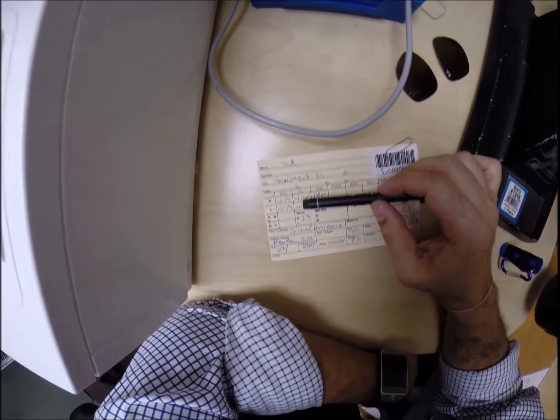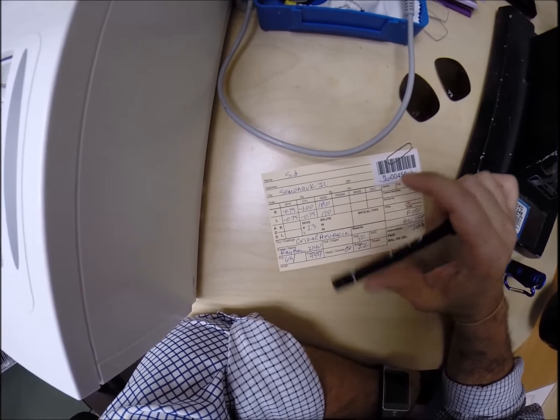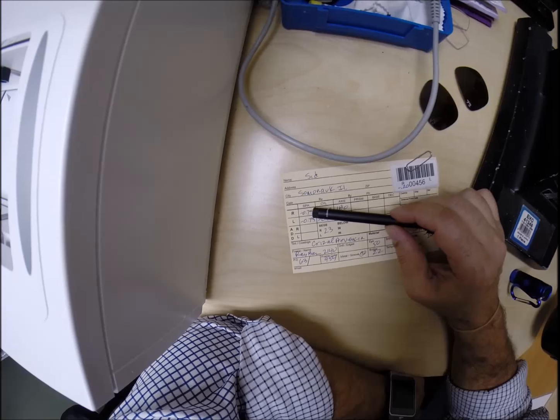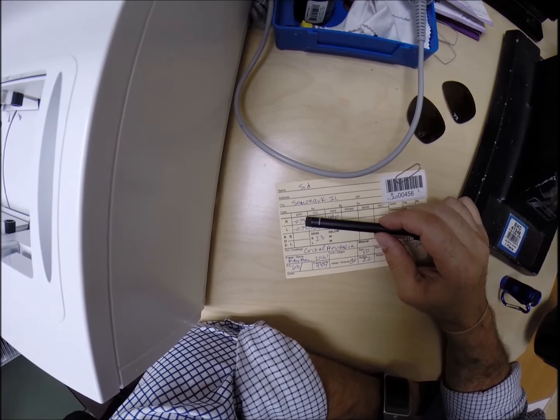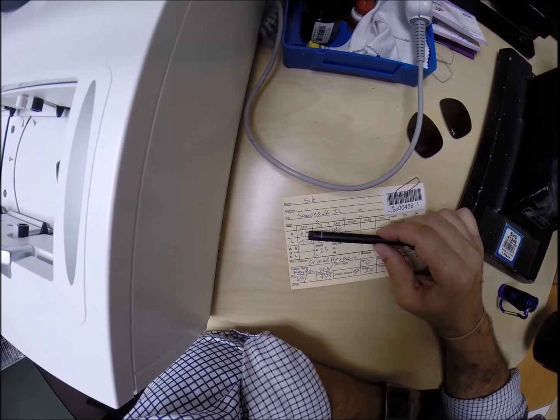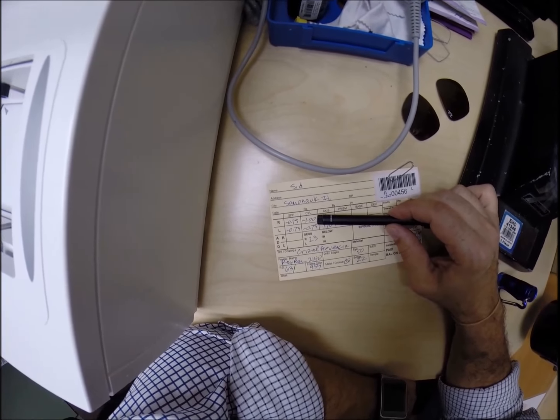You are nearsighted. With your glasses off, everything is much too large. That is why there is a minus sign next to your lenses. They minify until what you're looking at, the object, is the right size, the correct size. Once it's the correct size, you have 4 steps of astigmatism correction.